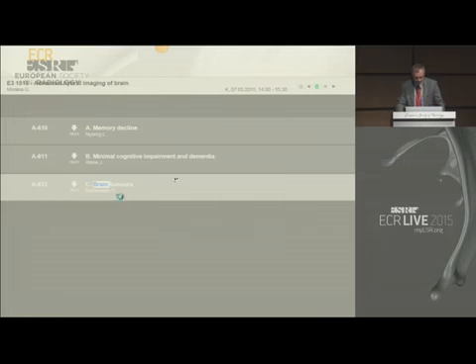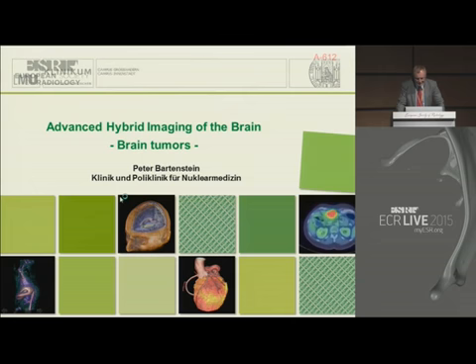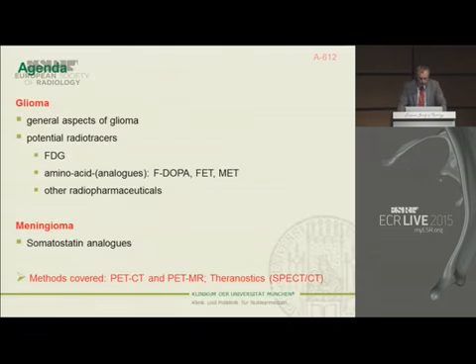Okay. Before it loads, I would like to thank the organizers for giving me the opportunity to talk about brain imaging, hybrid imaging of brain tumors. Also, I will show some PET-MR images. I will focus on the appropriate selection and analysis of the radiopharmaceuticals and relate that to MR findings, since I think this is of paramount importance to apply molecular imaging successfully into the clinical workup of brain tumors.